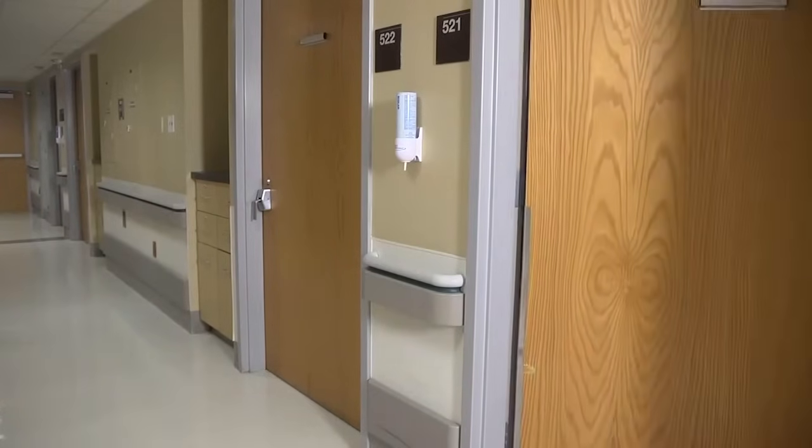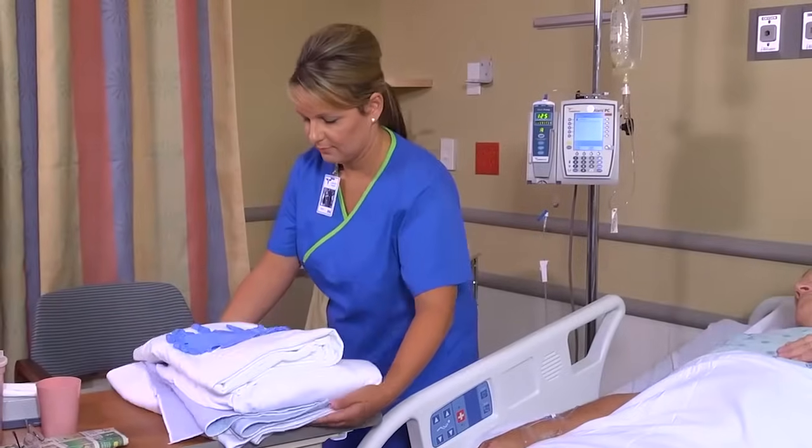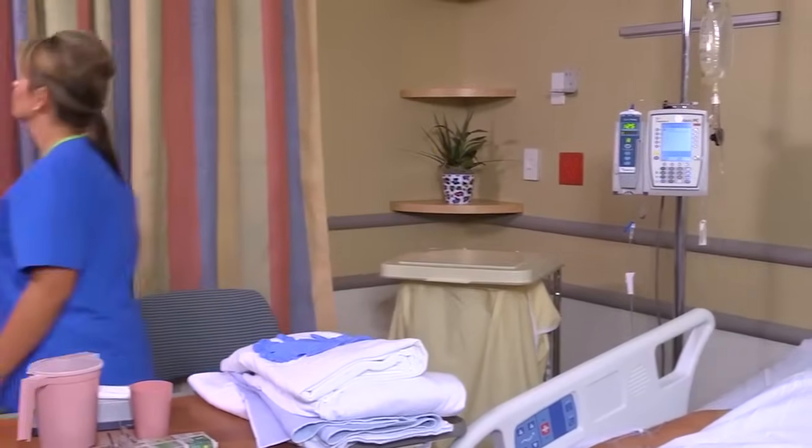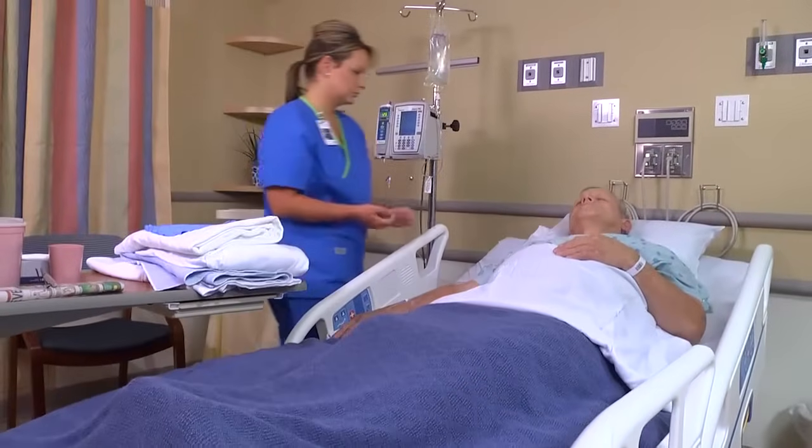To make an occupied bed, first assess any activity or mobility restrictions that might affect patient positioning. The patient's safety and comfort are of the utmost importance. Ensure patient privacy and introduce yourself to the patient.